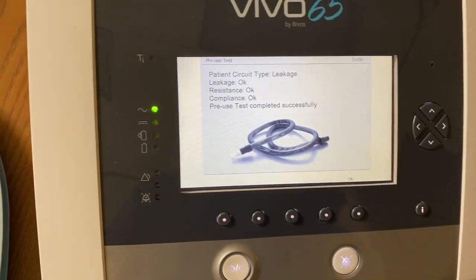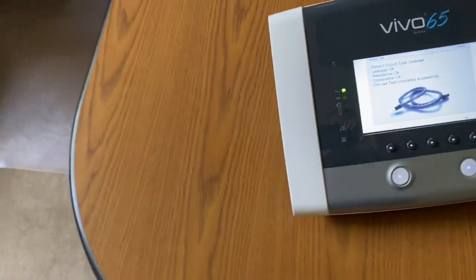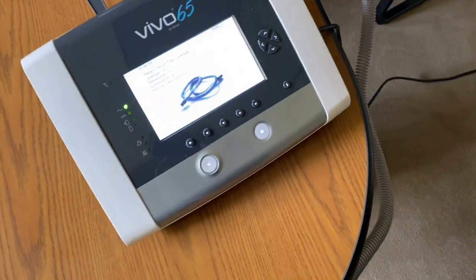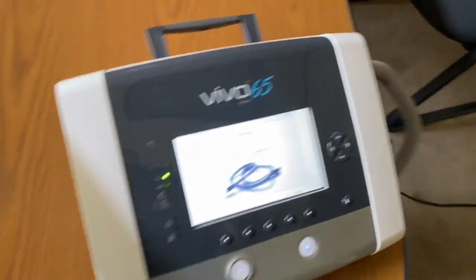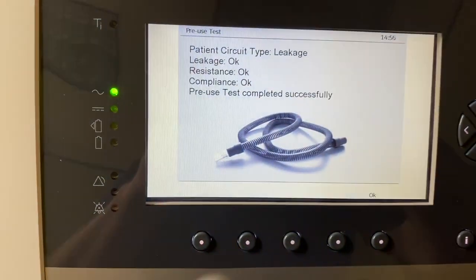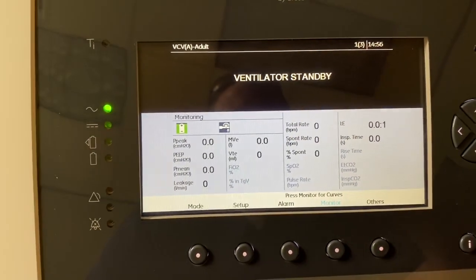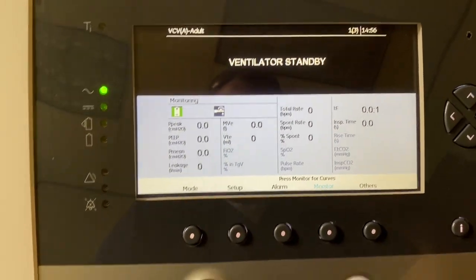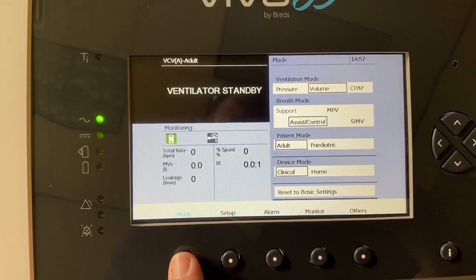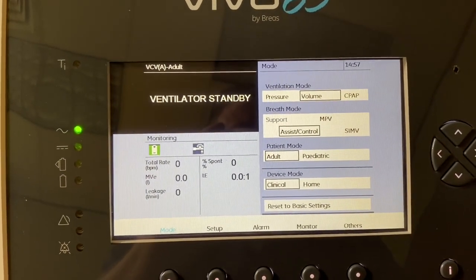You can now start using therapy. I'll go ahead and connect my patient circuit here. Press OK once the pre-use test is completed, and this takes you back to your home screen. You have the option to choose mode. When you press that, it will give you the option to do ventilation mode: pressure, volume, or CPAP.